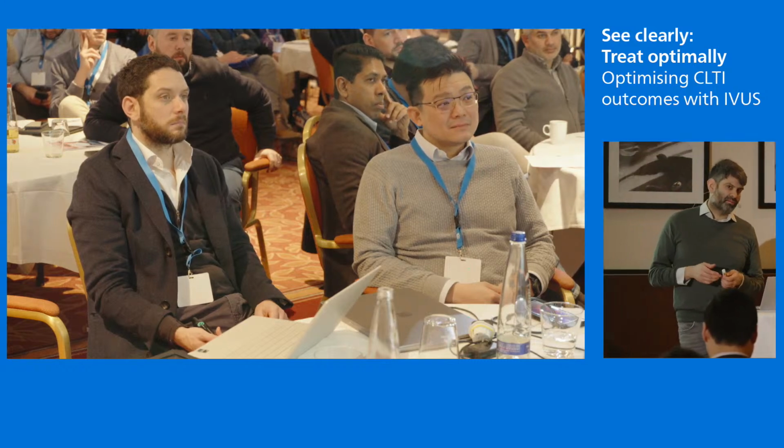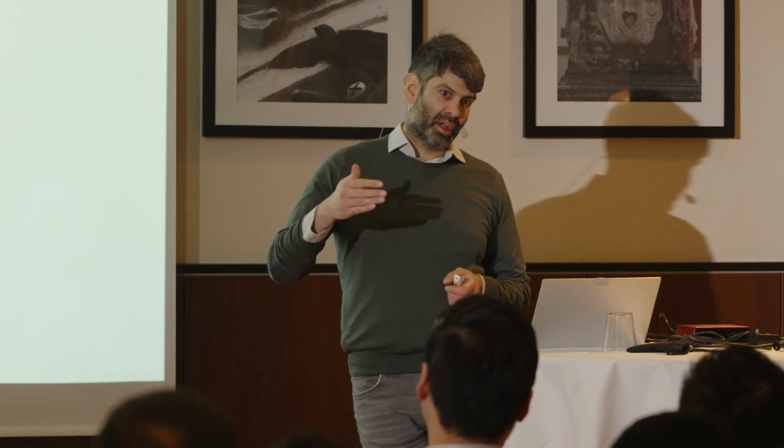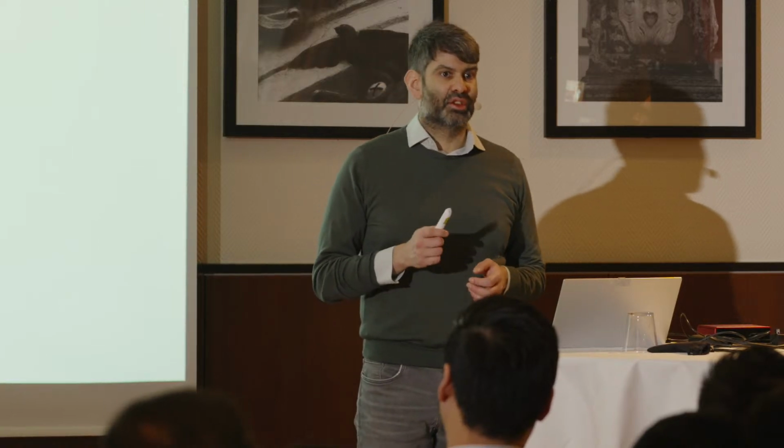So that may be, but almost always I will post dilate out to, if not the true vessel size as measured by IVUS, very close to it, and then a DCB to the correct size at low pressure. So I need a really good reason not to post dilate.